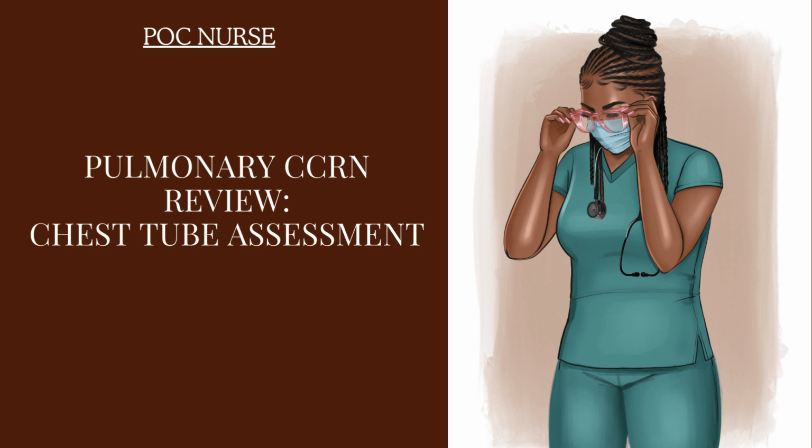So it's important to note that if this freshly placed tube is not showing tidaling, it might be kinked inside the patient or outside of the patient. The provider needs to be made aware. They can do a chest x-ray to visualize the tube inside of the patient to make sure that it's kinked or not kinked, to make sure that the patient is okay.